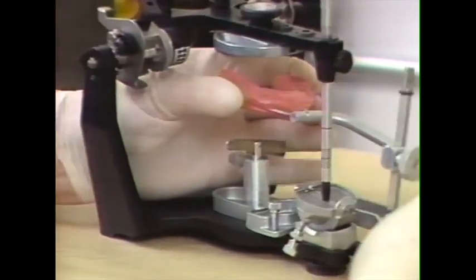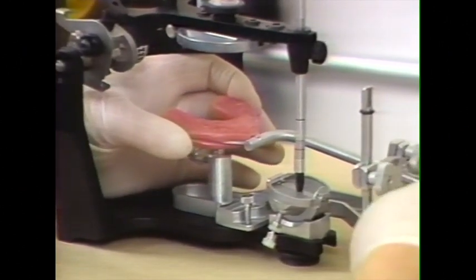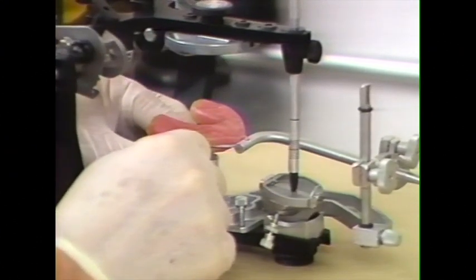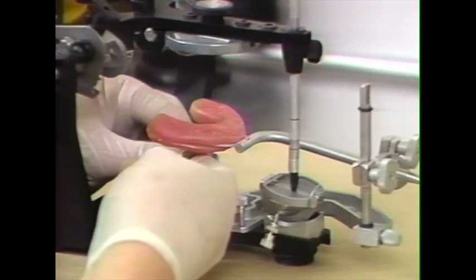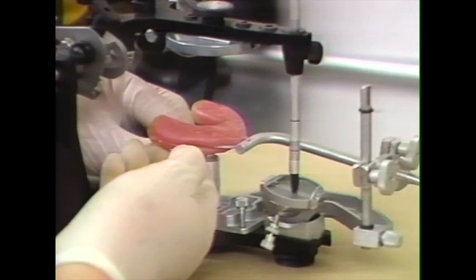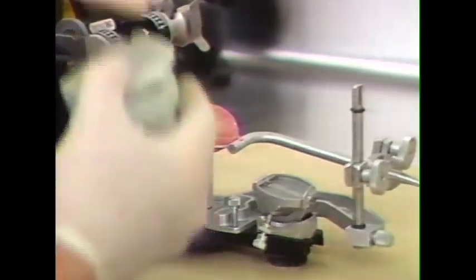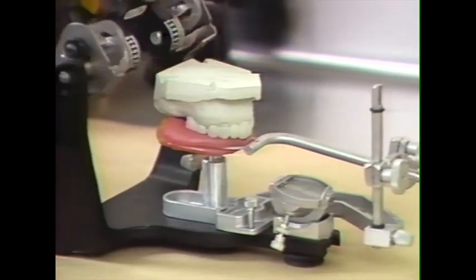And the facebow record is then placed into the anterior receptacle and tightened. The cast support can then be elevated into contact and tightened so that there's no chance of distorting the record when the cast is mounted. We then place the cast into the articulator, and we're now ready to attach it with plaster.